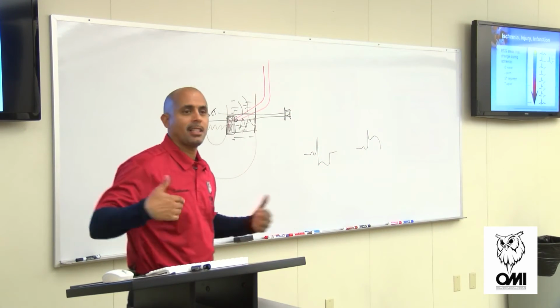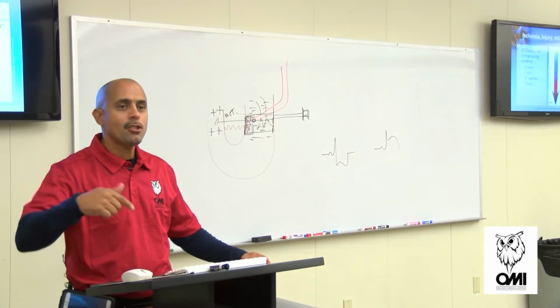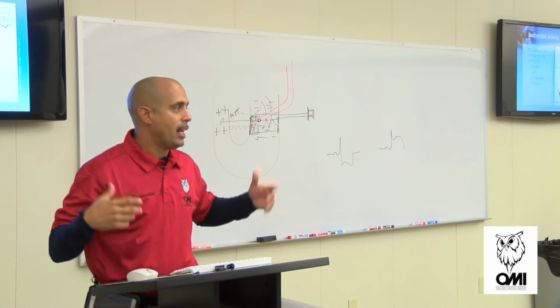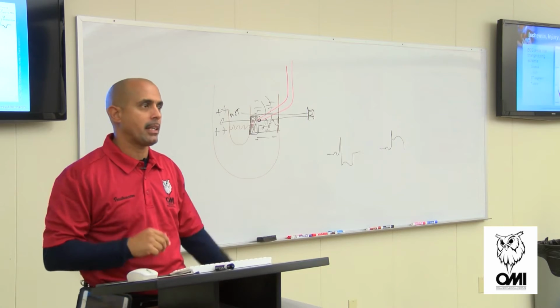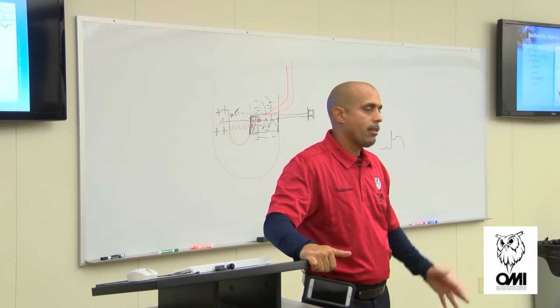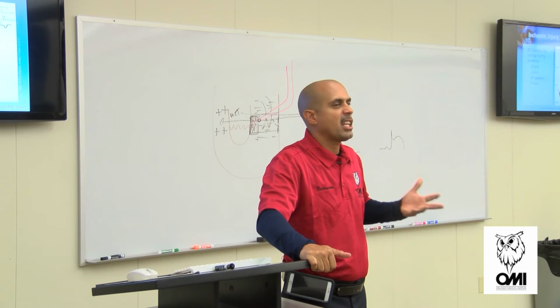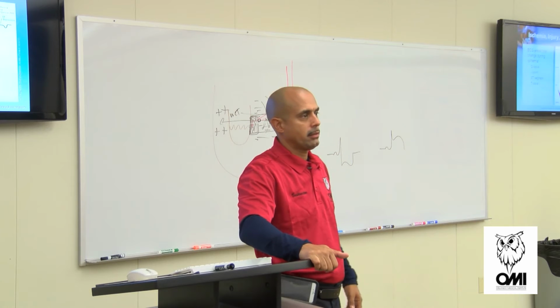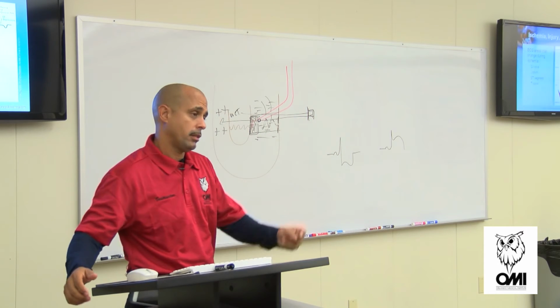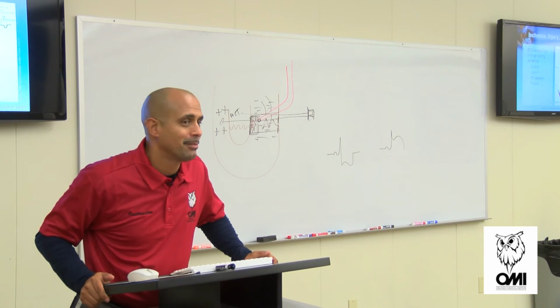But if you have a syncopal episode, everybody gets a 12 lead. I don't care. Unless you could tell me somebody said boo, and you fell out and you woke up, then I might accept that one because somebody scared the crap out of you and you passed out. Okay. Other than that, what does it hurt you? Does it take up all your time to do a 12 lead? No. You know what it takes me to do? My EMT, hey, do me a favor, do a 12 lead. That's what it takes. Right?